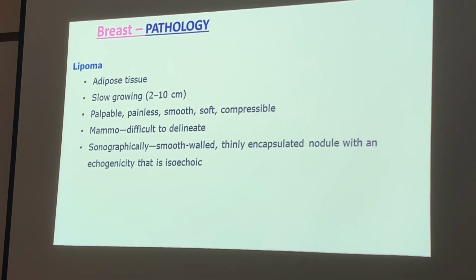One thing about lipomas is that if you have one, you probably have them in other places as well. You probably just don't know or feel them yet. Sometimes if you scan somebody and they have a lipoma, you can scan other areas near that area and find other lipomas that are maybe smaller than the main one. You had a guy come in once with a whole bunch all over his body, but you only measured the biggest 3. Anytime you do anything on ultrasound, it's always going to be the largest 3.